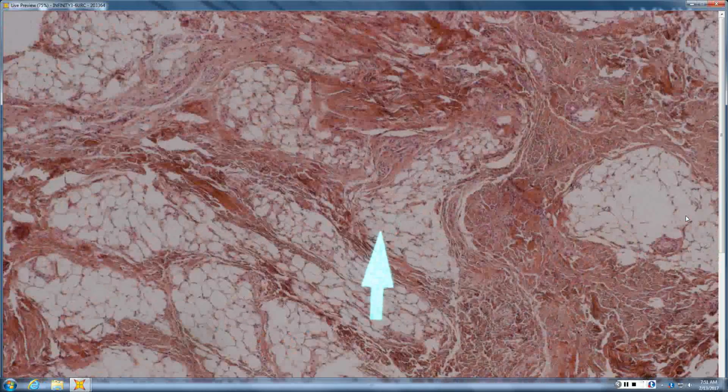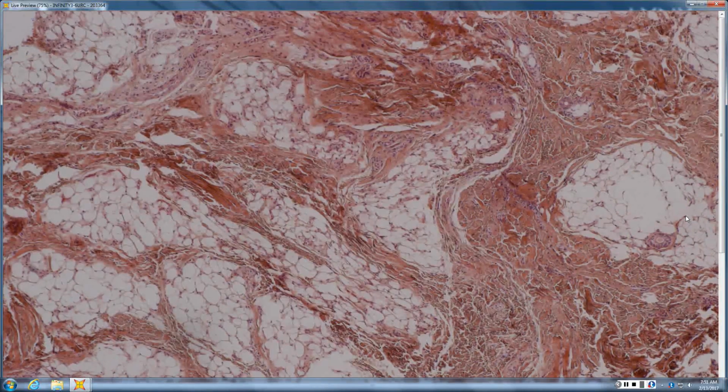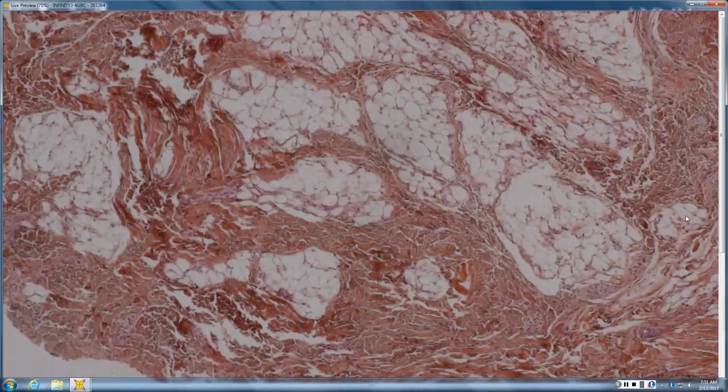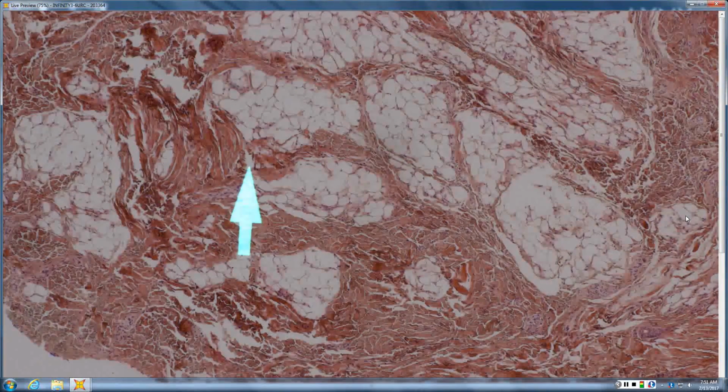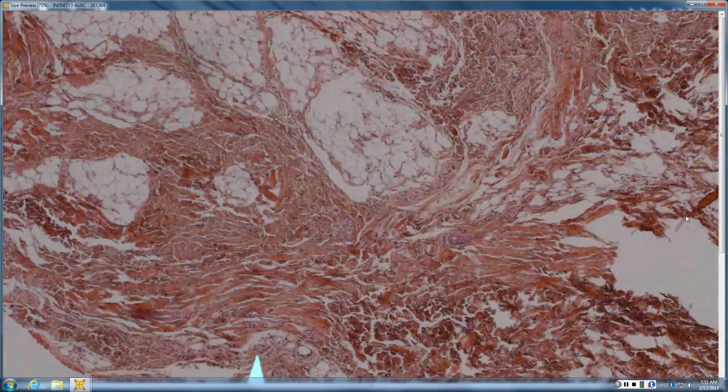So we're down in the fat. Correct. And what's wrong with the fat? Is it all fat, or is there a lot of fibrous stuff? There's a lot of fibrous stuff, I can tell that's pink. So there's a lot of the fat that's not fat, right? It's fibrous. And is the collagen normal or is it weird? Weird. So you've got hunks of weird collagen in the fat. Some areas where it's more cellular, spindly and a little myxoid. Other areas where it's more mature.